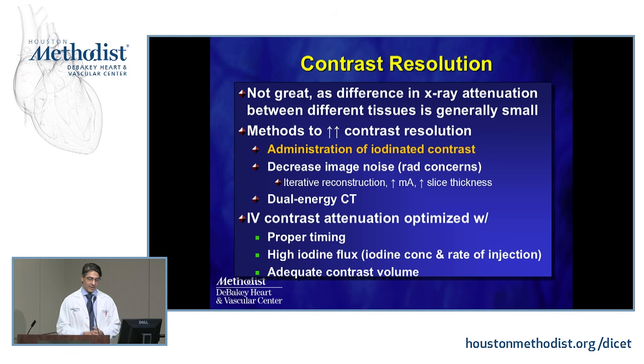And the reason is through the intravascular system. And the rest of the optimization of the images in order to improve our contrast resolution is really how we time the bolus and how much iodine contrast you should give and at what speed and volume. Those are what we play with. But the main thing is, you want to improve contrast resolution.